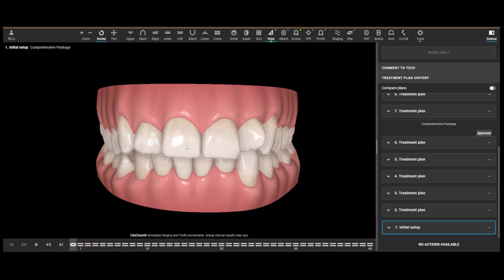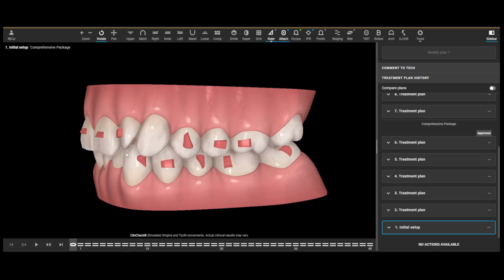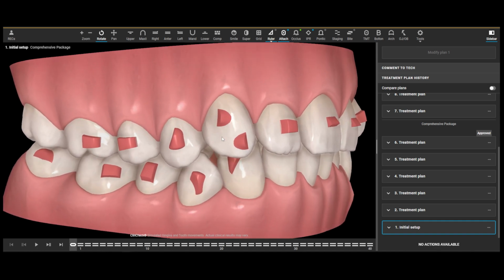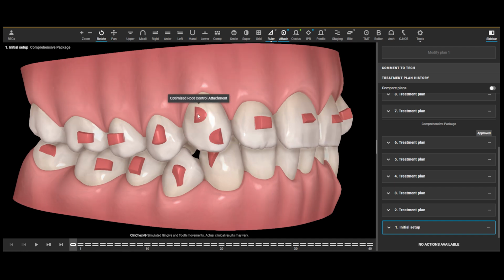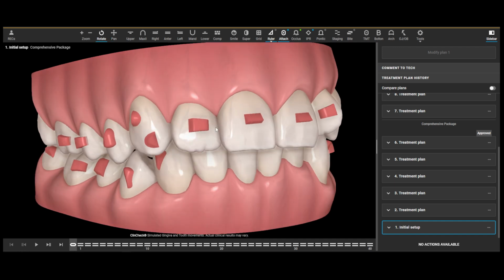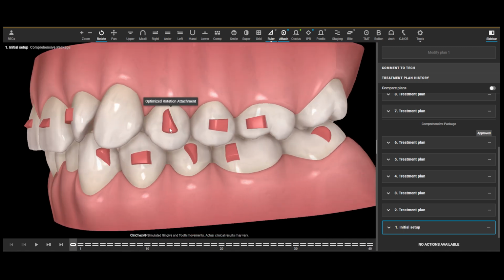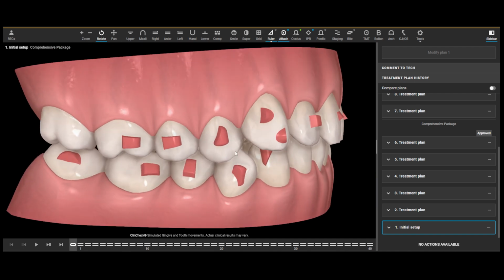So let's take a look at the ClinCheck. Here's what we received on our first ClinCheck from the technicians. There's a number of optimized attachments. Invisalign's attachments, when you hover over them, will say optimized, whereas a conventional attachment that you've made a choice to change, when you hover over it, is just going to tell you that it's a rectangle attachment. So that's how you can tell which attachments are present.